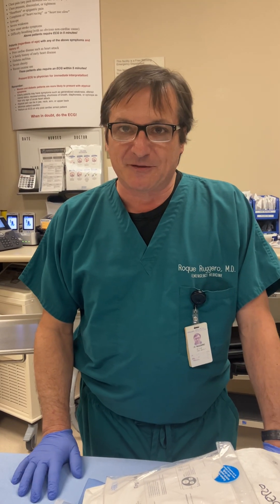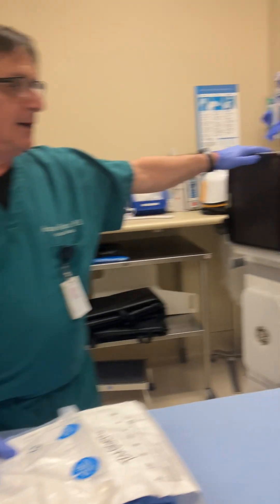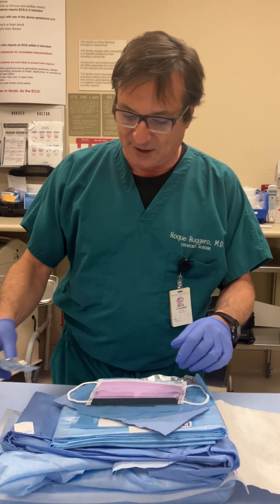Hello, I'm Dr. Ruggiero. We're going to walk through the steps of placing a central line. I have my central line kit, and I'll be using ultrasound for ultrasound-guided central line placement.